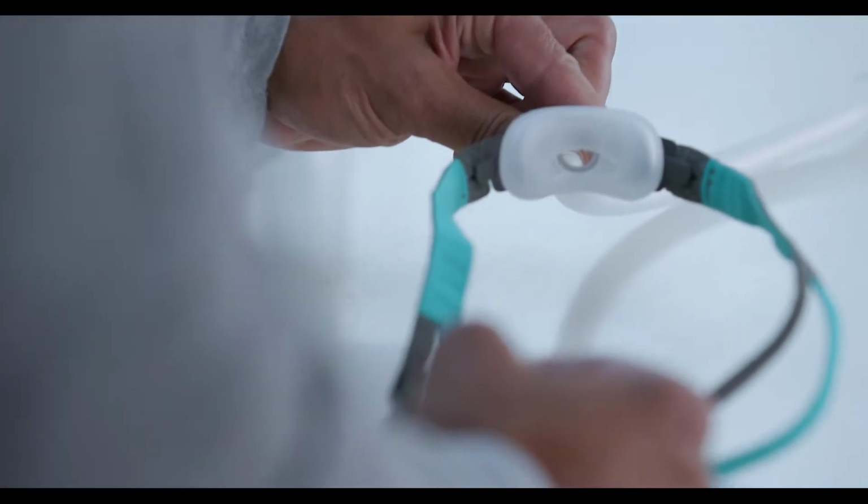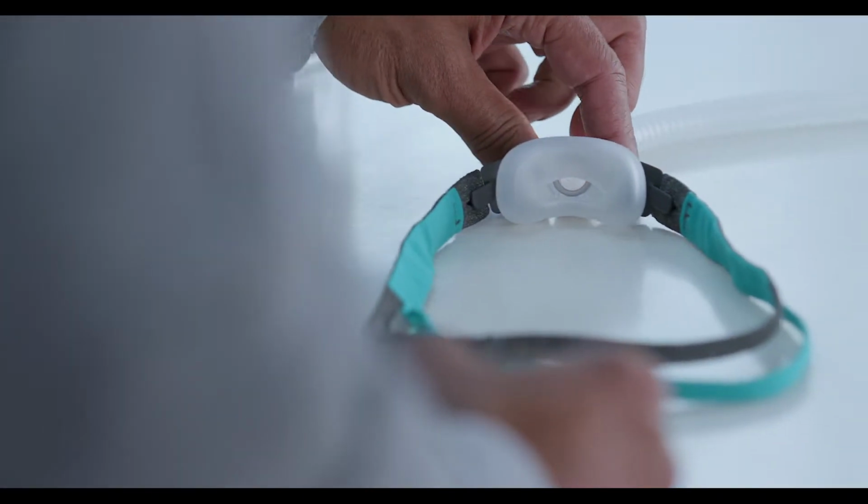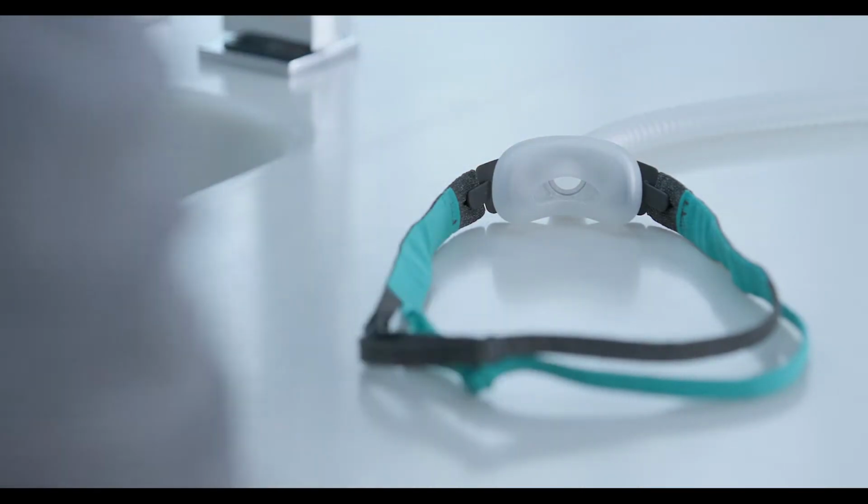Keep your Philips Therapy Mask 3100 NC or Therapy Mask 3100 SP clean by washing it regularly. You should also wash it before you wear it for the first time.